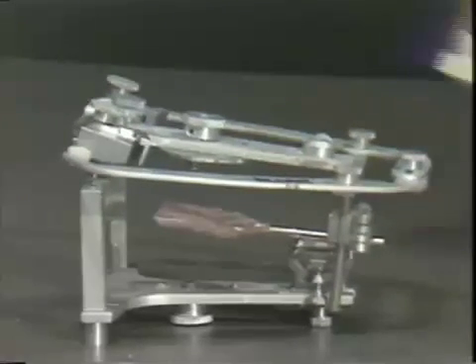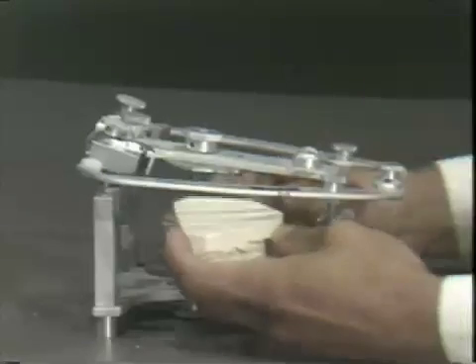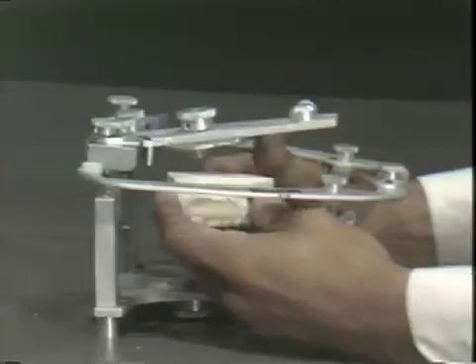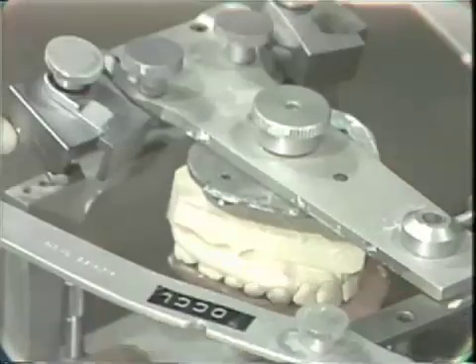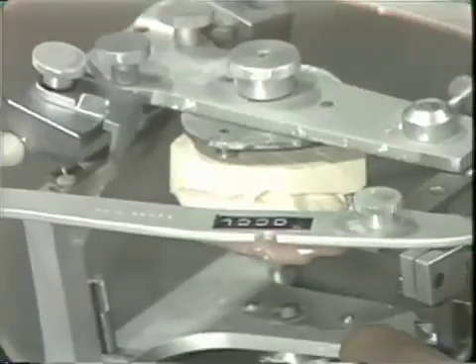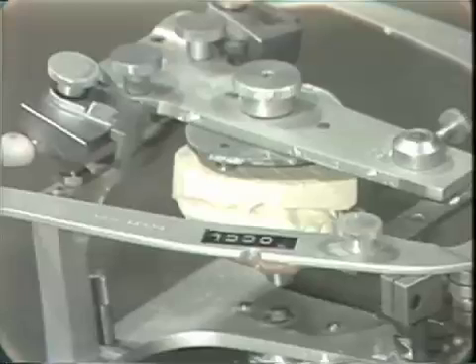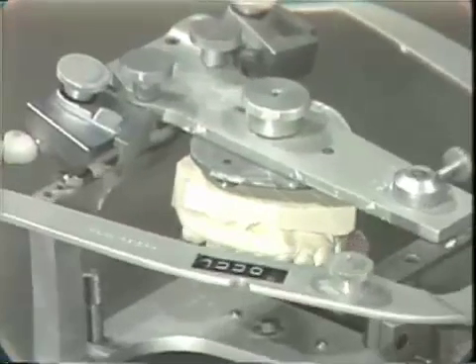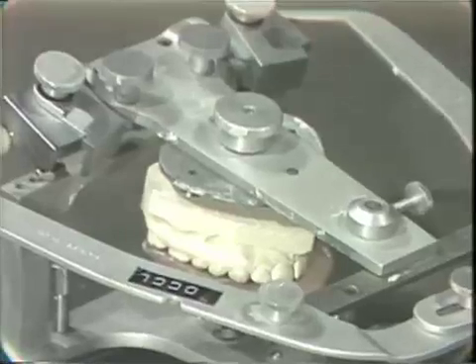It is generally easier to use the lower member to hold the instrument up. What one would do is take the cast that has been furnished, place it into the previously established index marks on the bite fork, and then mount it using impression plaster between the ring and the cast. When we come back from this commercial message, we will have the upper cast mounted.